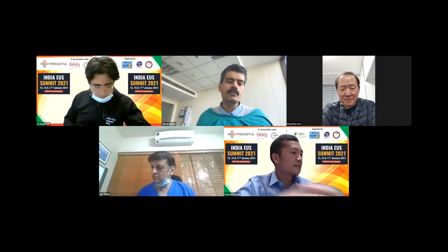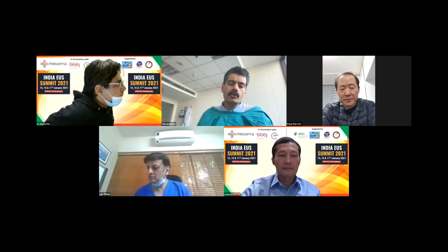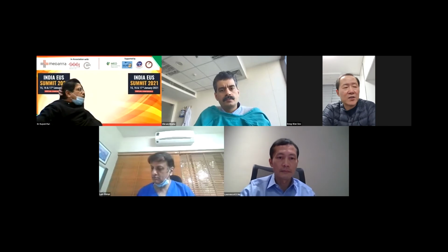I have only one small question, in fact, two small questions. What is your view about placing a pancreatic duct stent before putting in ethanol? Number one. Number two, have you thought of contrast EUS to see the viability of the remaining cyst after ethanol lavage? Okay. The first question, pancreatic duct stenting, I think it's a good strategy when we are targeting a cystic tumor showing communication with the main pancreatic duct.